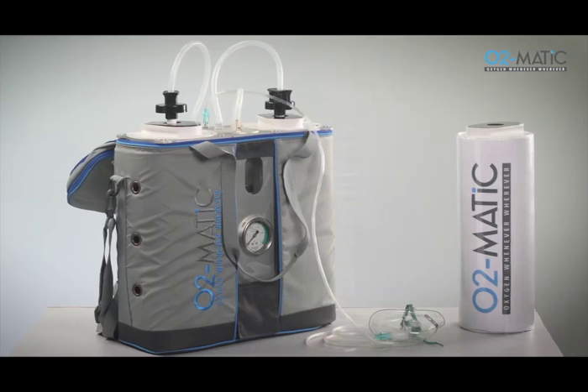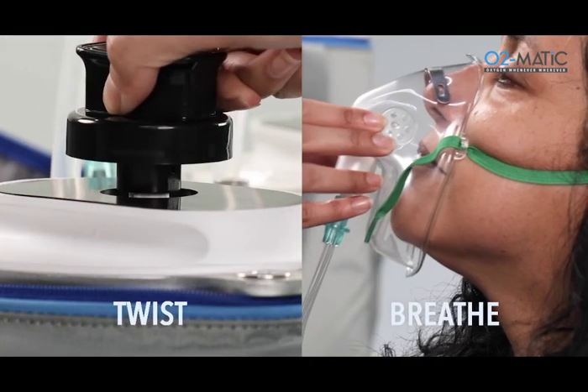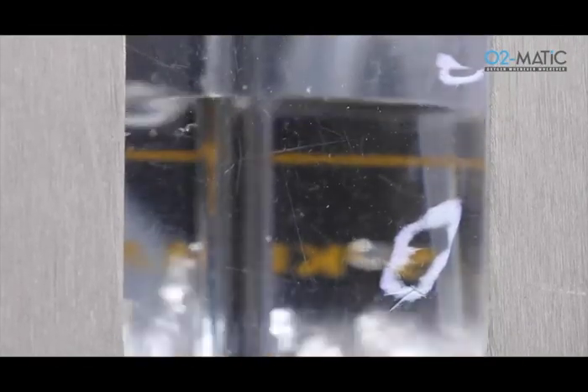In the event of a critical emergency, O2Matic's Portia delivers medical oxygen in less than a minute. Just twist and breathe. Oxygen generation starts in less than 40 seconds.